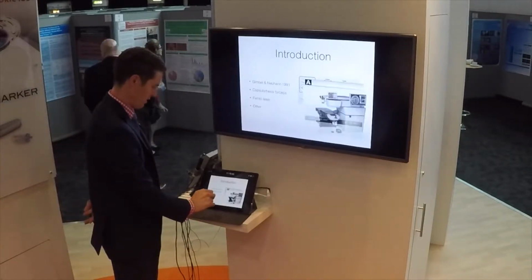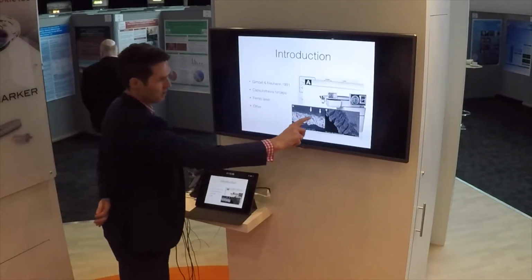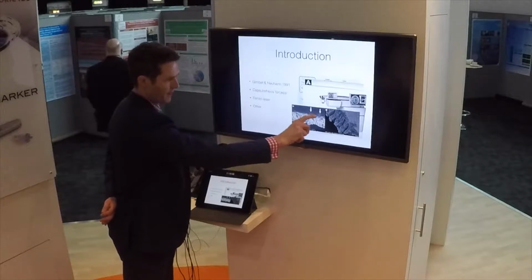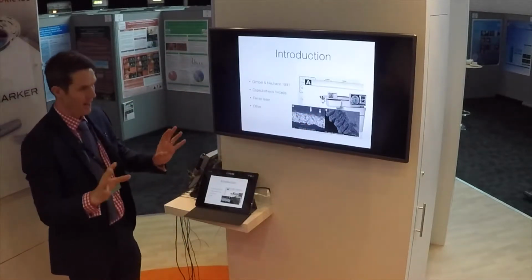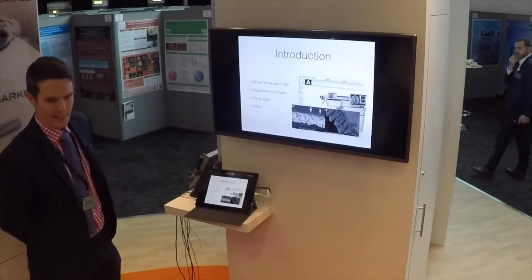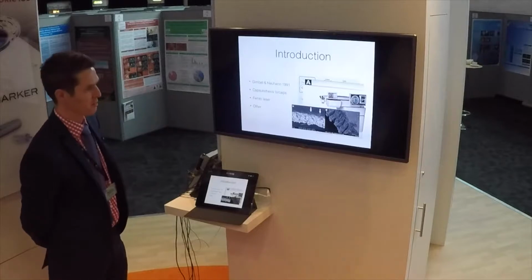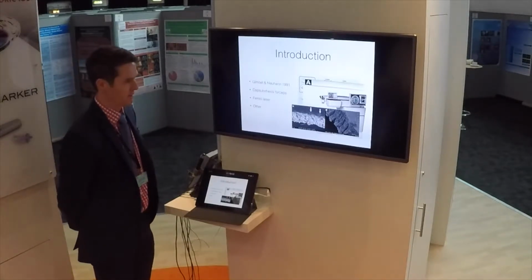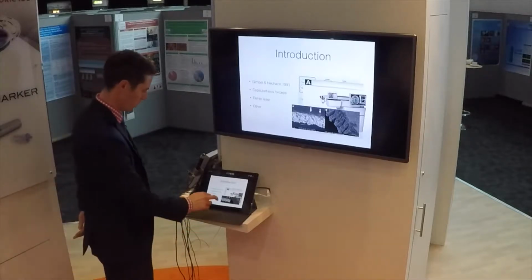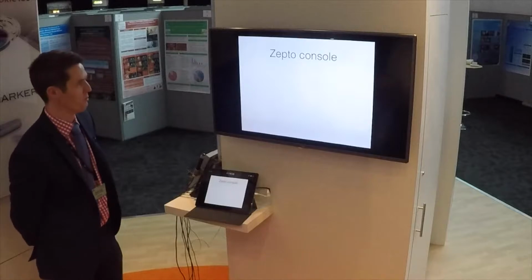If you have the same with a femtosecond laser, then you tend to get a very ragged edge, with spots outside where the delivery of the laser is, and testing has shown in the lab that they're approximately equal in strength. But of note, if you look at the big studies, there seems to be an increase in anterior capsular tears clinically in femtosecond laser cataract surgery. So with that in mind, what are your alternatives on the market at the moment?